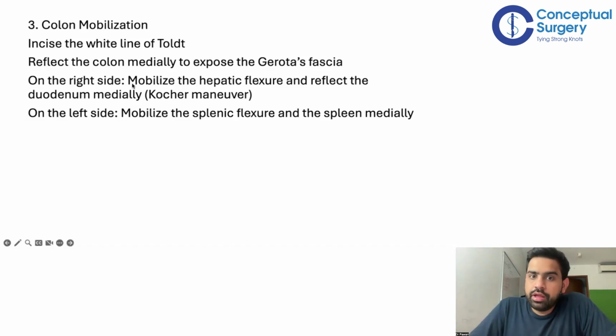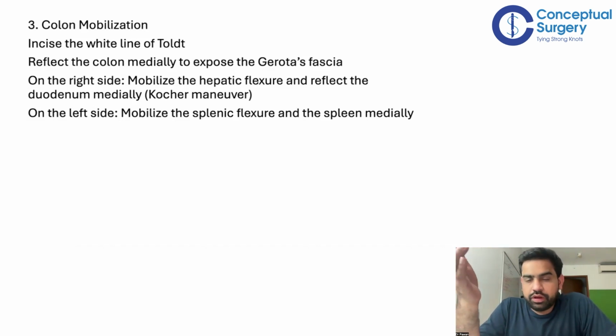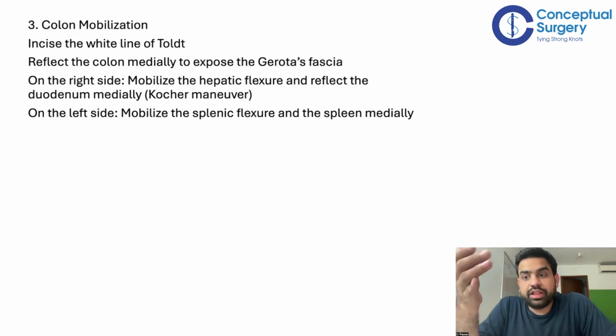On the right side, mobilize the hepatic flexure and reflect the duodenum medially through the Kocher's maneuver, because you want to reach the kidney. On the left side, you mobilize the splenic flexure and the spleen medially. Okay, you don't mobilize the entire spleen medially.